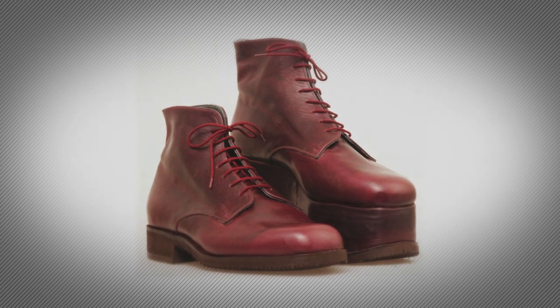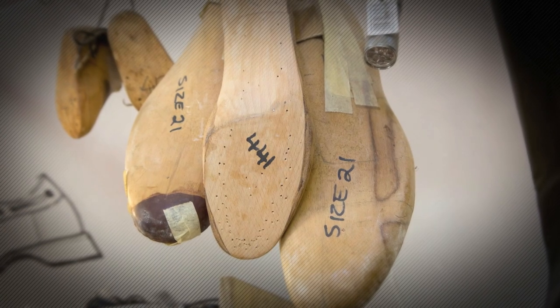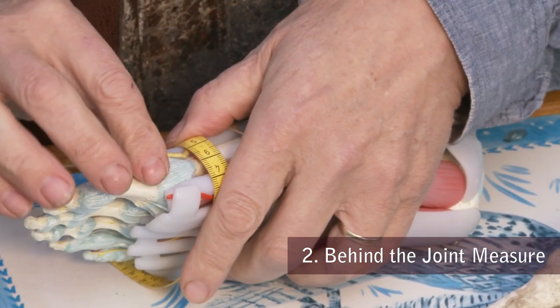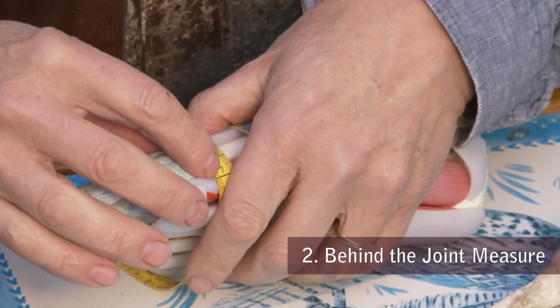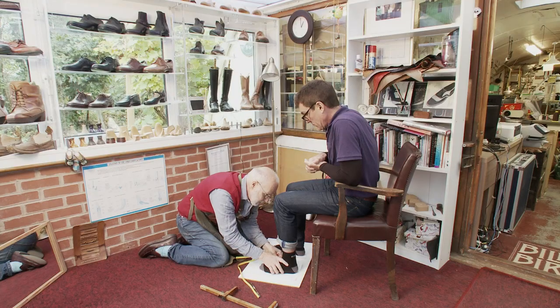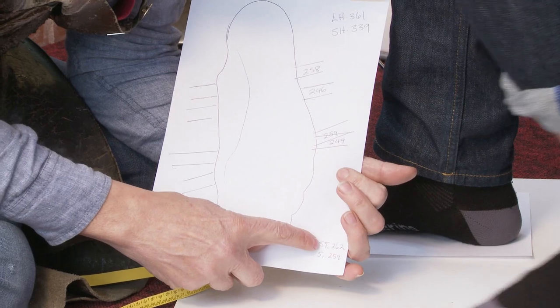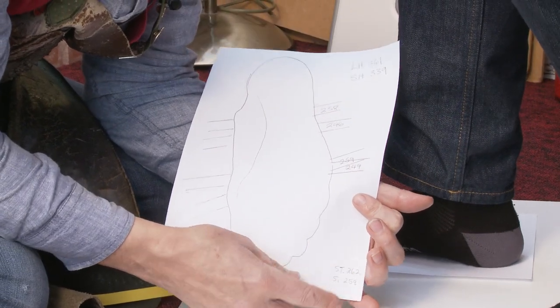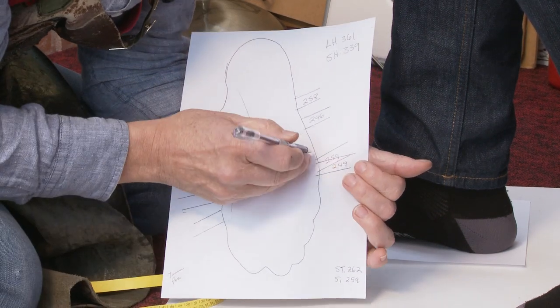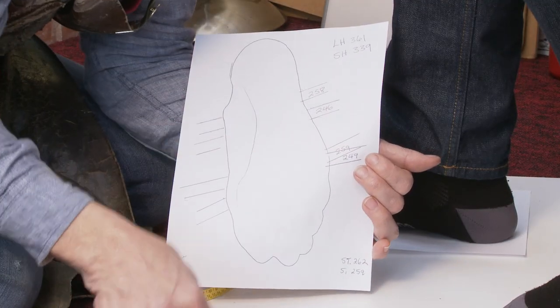A successful orthopedic shoe begins with producing the last. We start by learning how to measure the foot — coming around into the soft tissues behind the first toe joint. That short heel is a very critical measure. So if we take the foot off, here we have a standing length, a sitting length, and a trace of the foot. We know that that trace is three and a half millimeters larger than the foot.